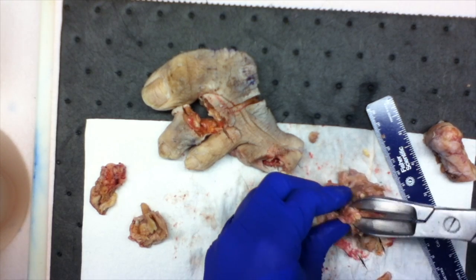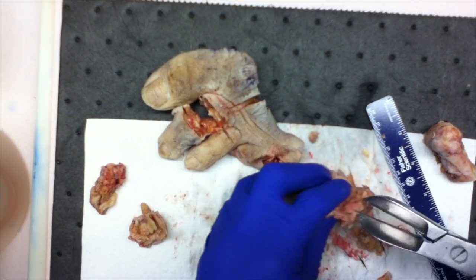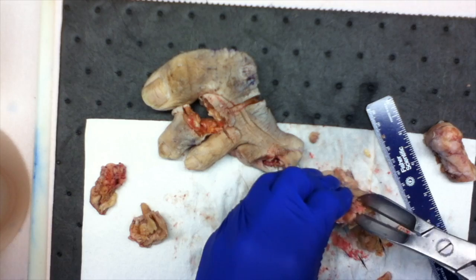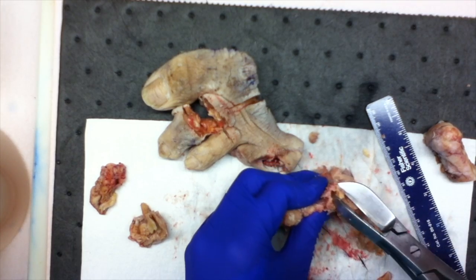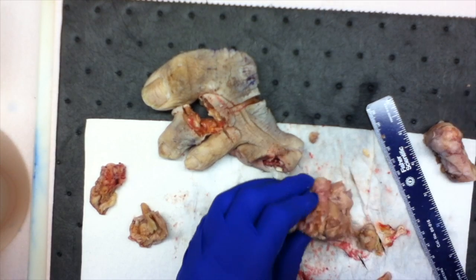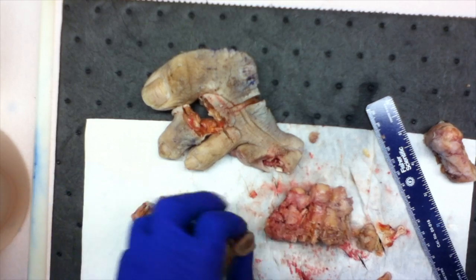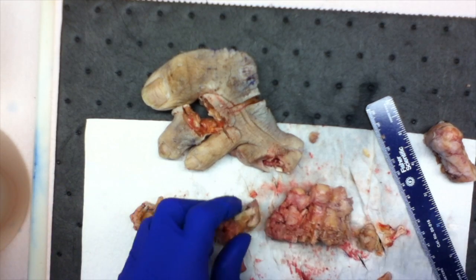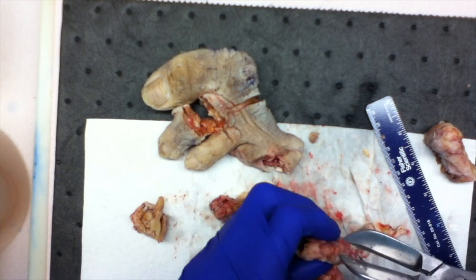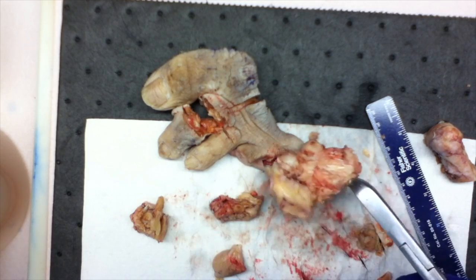Basically, some people use a saw for this. I typically don't like to get the saw dirty on toes when I can just snip off what I need. Some people like the hammer and knife. So here's the fourth metatarsal bone margin.